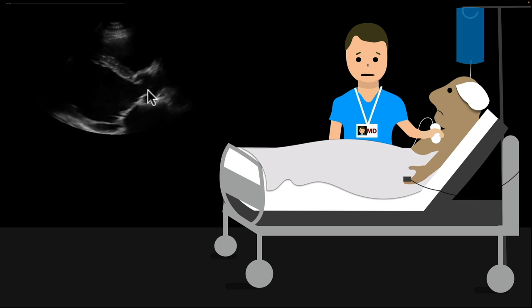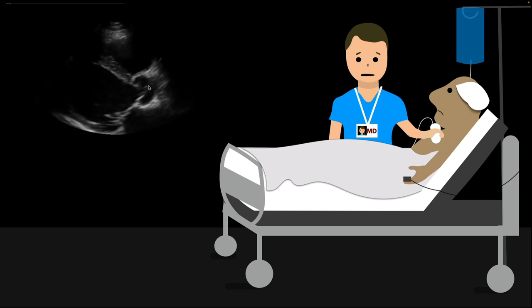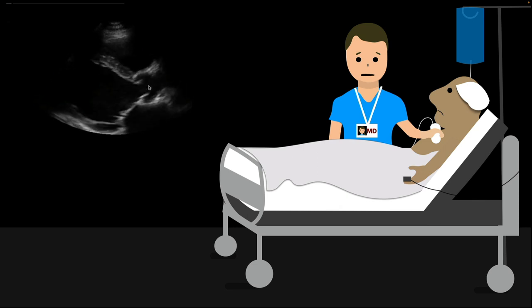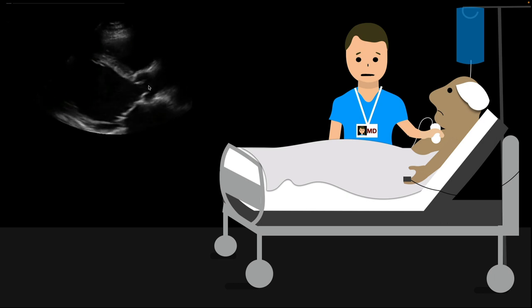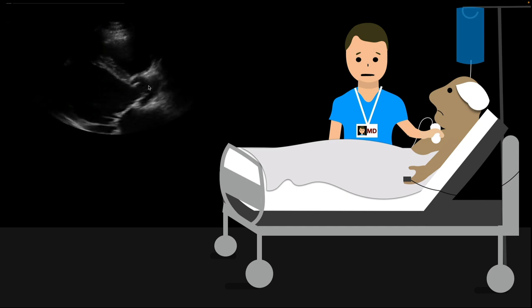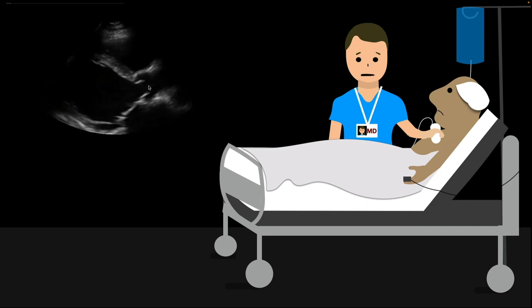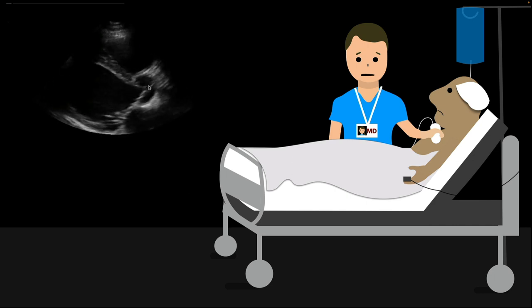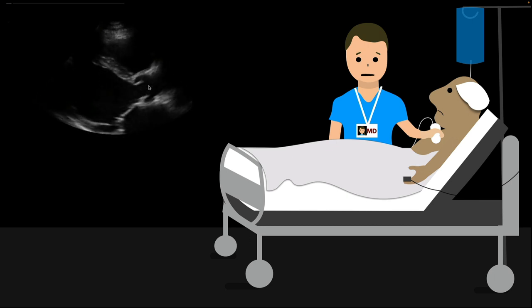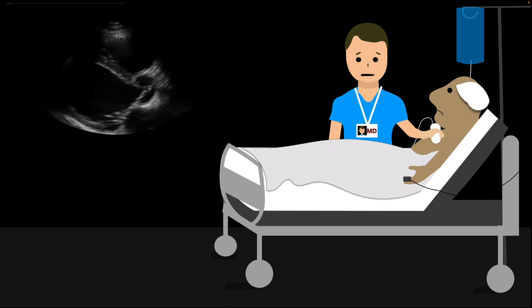What does this patient need? They need a PCI. They've got to get this fixed, and possibly a balloon pump to decompress that left ventricle — because it is big and engorged. Does this patient have a pulse? They have forward flow — the aortic valve is opening. They may have a POCUS pulse but it could be very weak. This patient might even be mistaken as PEA without ultrasound, because the rhythm looks organized but you may not feel a pulse. But this patient isn't in cardiac arrest — the heart is working.